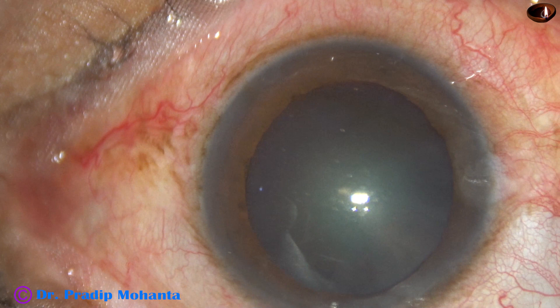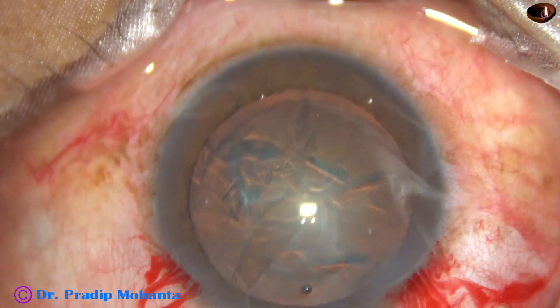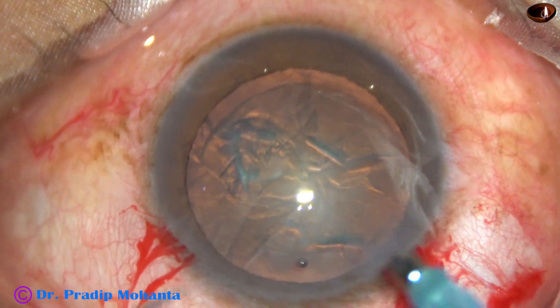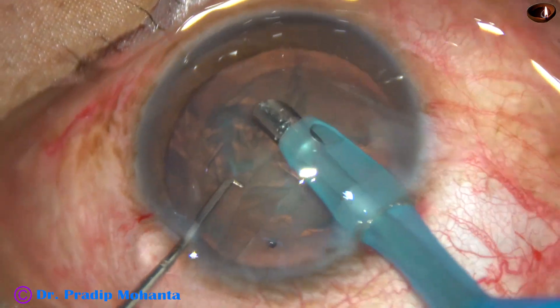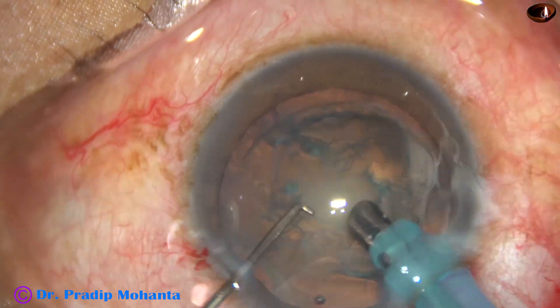This is the first case. Nucleus sclerosis is about grade 1. After capsulorexis and hydrodissection, the tip of the FACO needle is introduced into the anterior chamber. It goes bevel down. Some superficial cortical lens matter is removed.